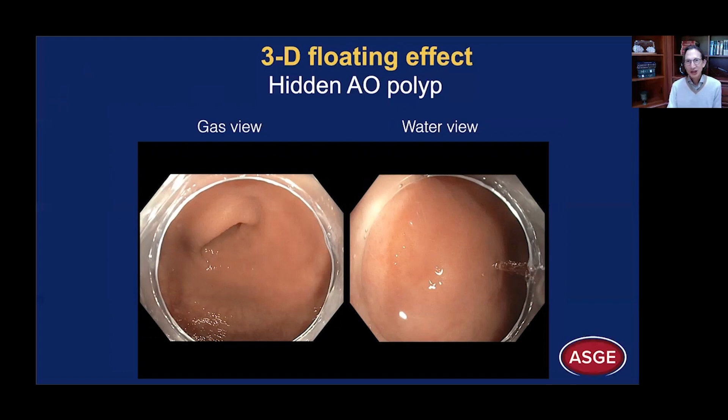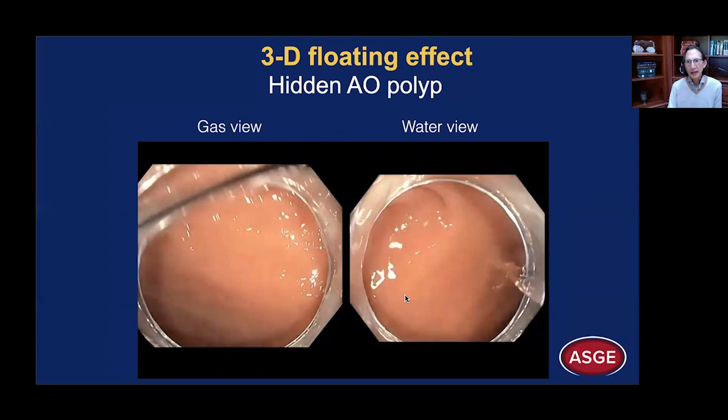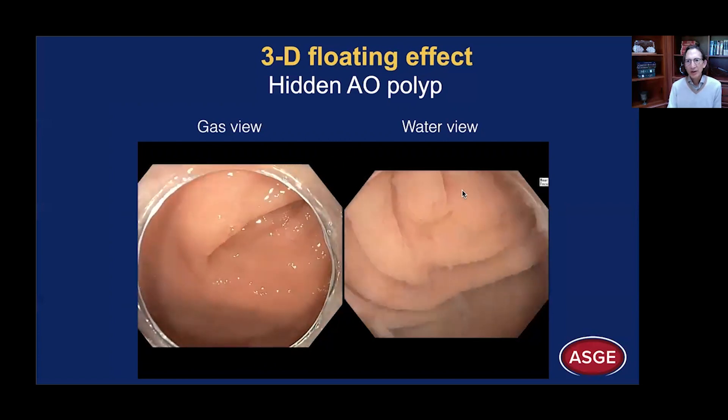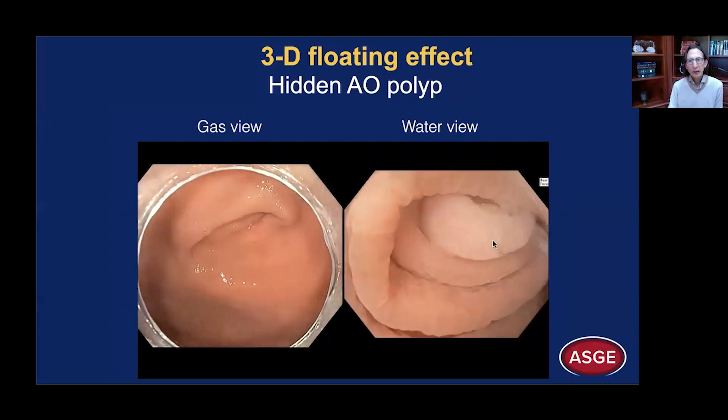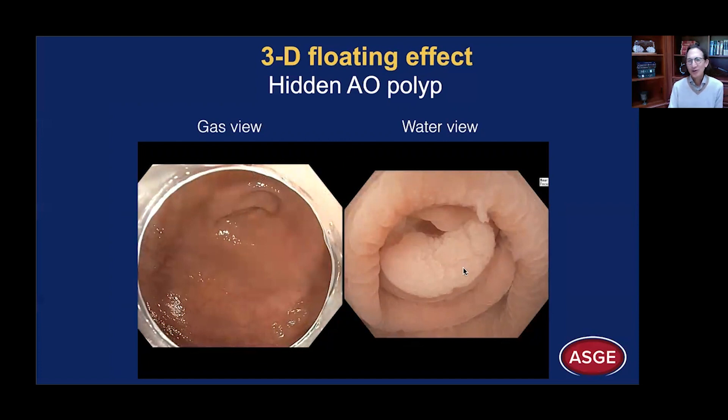Sometimes we can discover polyps that may be hidden in caves such as the appendiceal orifice. Here's the gas view; here's the water view. In this video, you'll see that after infusing water into the lumen, we still see the appendiceal orifice. But as we watch it underwater, the lumen contracts and this polyp crawls out of its cave and exposes itself to our view. Often these appendiceal orifice lesions are SSAs, and so they are very flat — underwater imaging with its floating effect facilitates identification of these flat polyps.